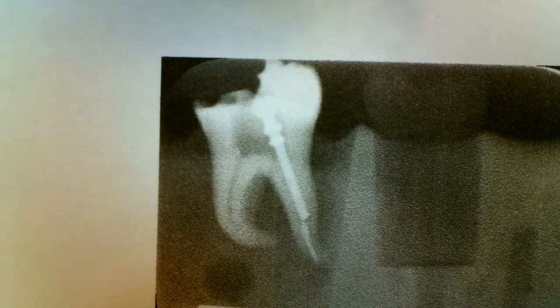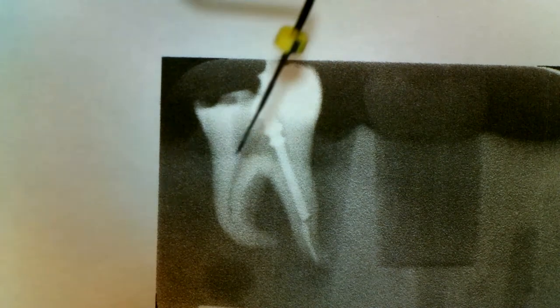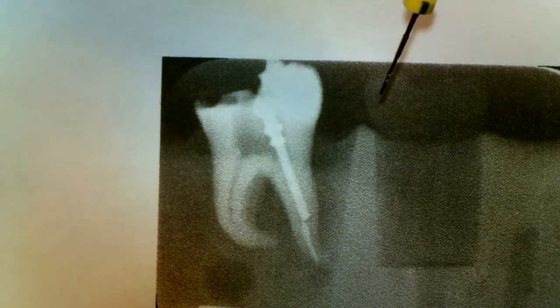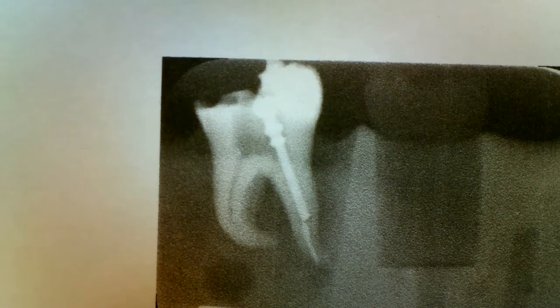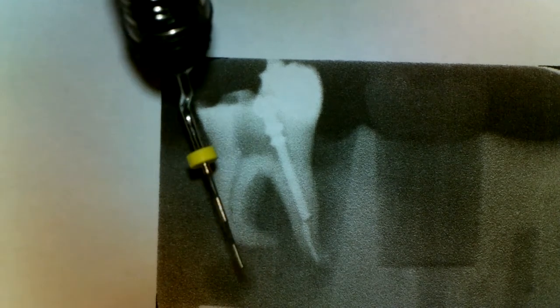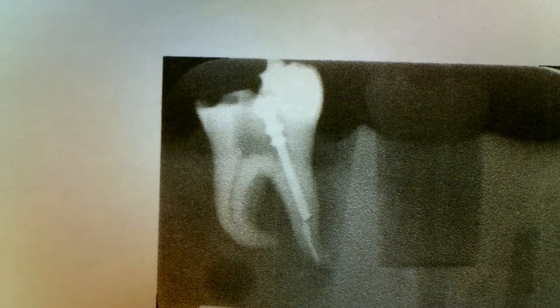I'm not real thrilled with the thinness of this wall here, so maybe we could have stopped with one smaller post. But here's the example — the post drill went down to where it stopped going easily. If I had pushed to make it go the whole length, I would have torn out the distal side of the root and possibly destroyed the tooth. When you're drilling out gutta percha, if the drill doesn't go easily, you're not in gutta percha — don't go any farther because there's an anatomical reason that the post drill is not going deeper.